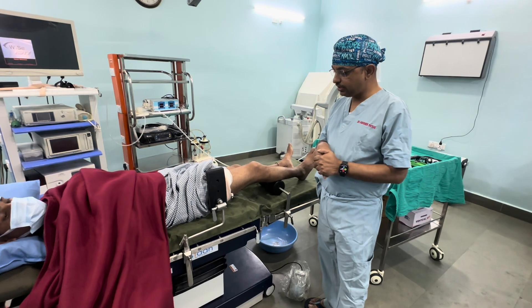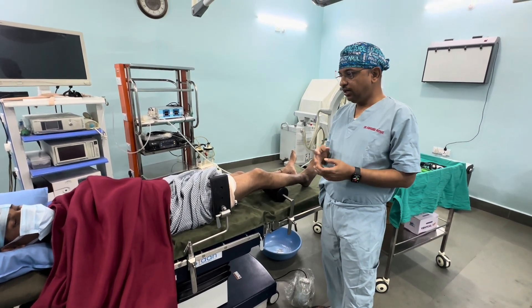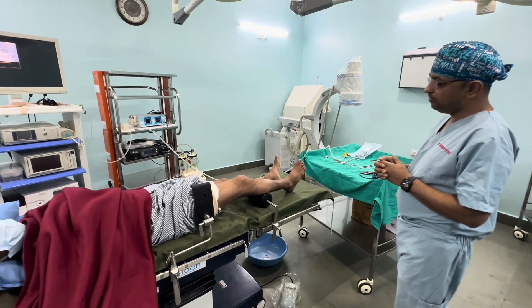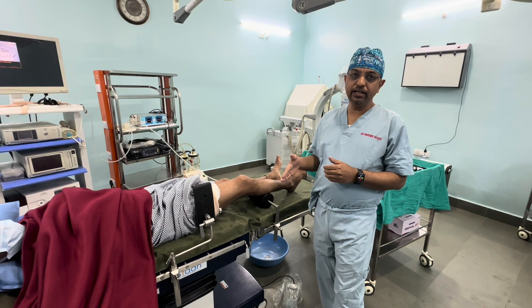Today we are going to discuss the basic OT setup in arthroscopy. This is a volunteer who has agreed for this demonstration, and we are operating on the right lower limb.